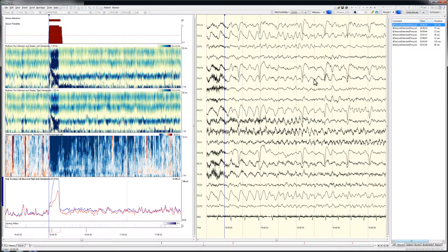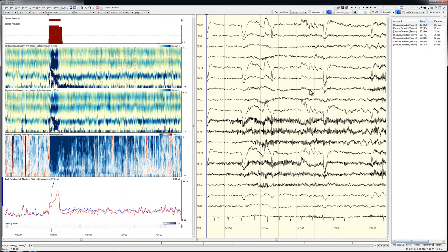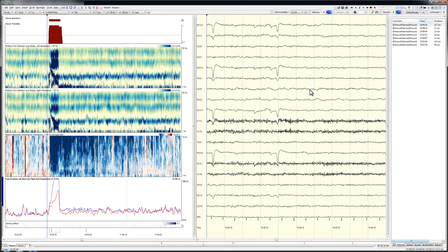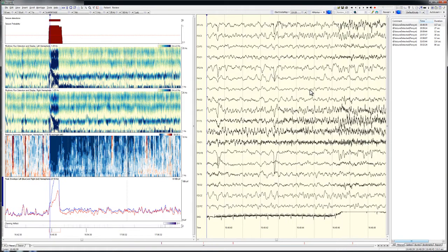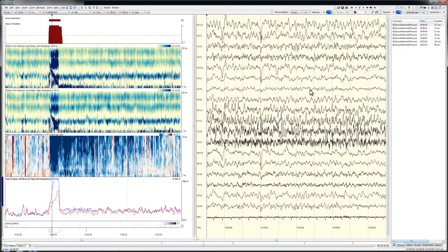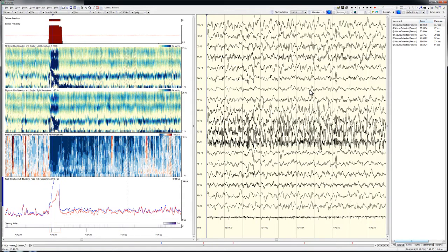and a left greater than right increase in amplitude shown on the EEG peak envelope graphs. By clicking just before the seizure related changes on the trending graphs and then paging forward through the associated EEG, I'm able to rapidly confirm the ictal nature of this event.